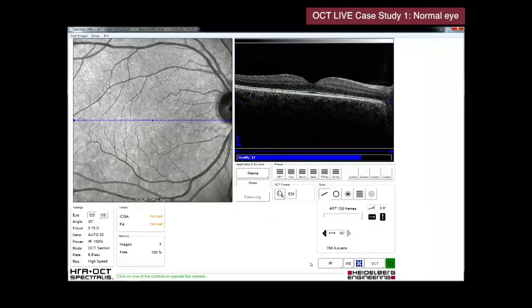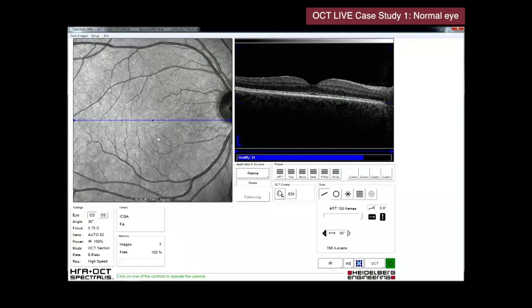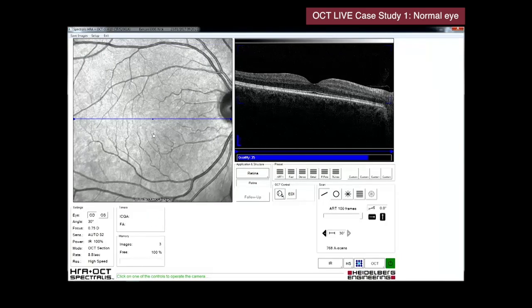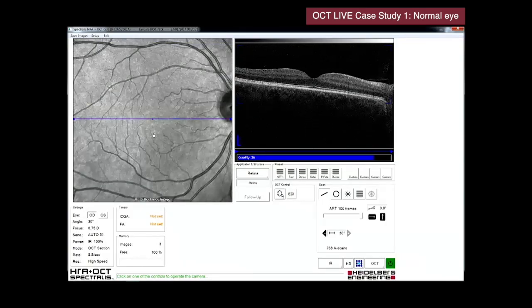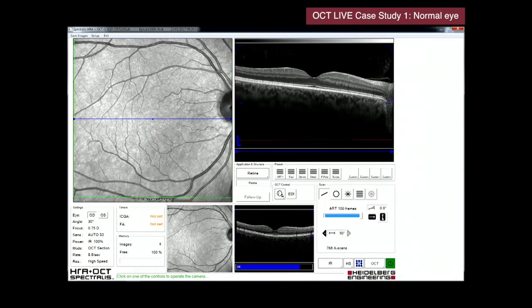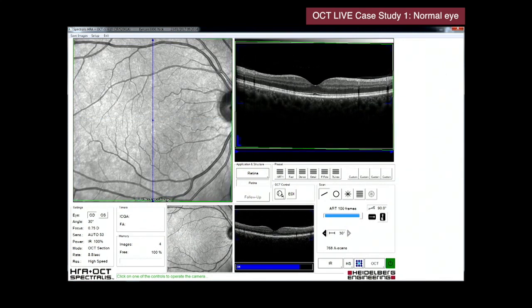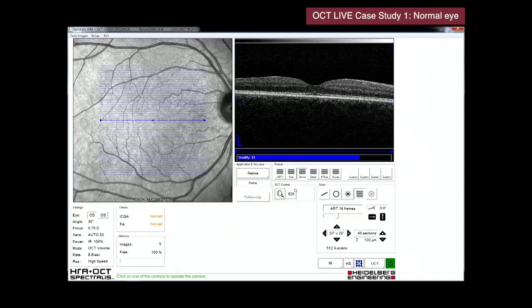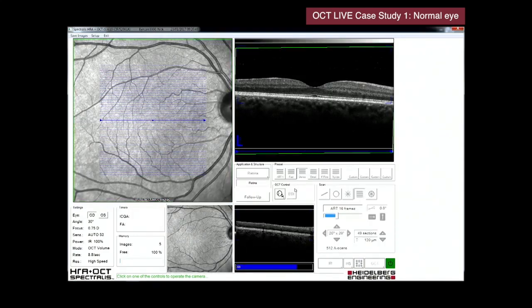The first thing to do is to identify the central fovea. And what we're looking for is this shallow depression. And note the bright reflex at the center of the fovea. This means we've got a foveal-centered scan. We're then doing a scan in a vertical orientation. And what we're looking for here again is any structure that's going to conform to the midline. So if you've got a vascular occlusion, in glaucoma you see arcuate retinal fiber loss. Doing a vertically orientated scan allows us to identify change.